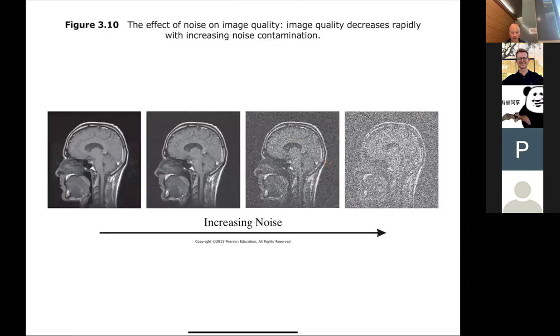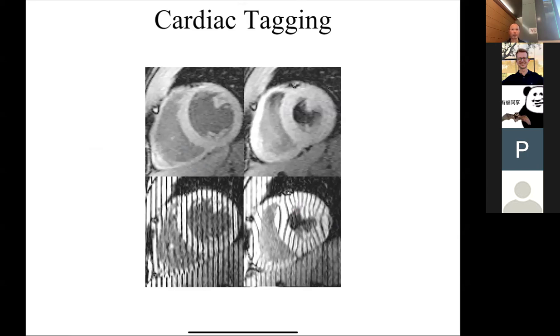Okay, so that's all I'm going to talk about for RF. The most important thing is just to have a vague sense of the slice selection, and to know that slice selection is just the simplest case of this sort of excitation k-space, and that you can go further and essentially design any pattern of magnetization you want and excite it using the right combination of RF and gradients. Okay, so any questions on that?